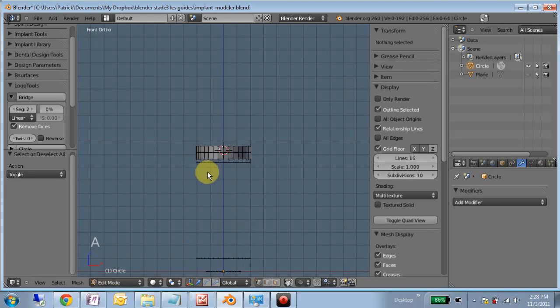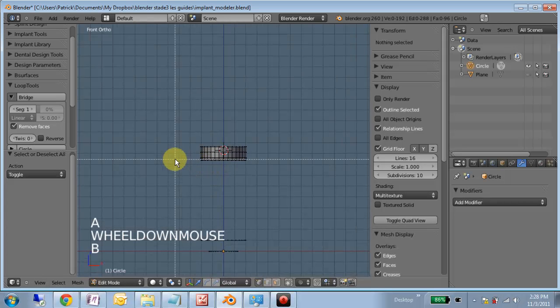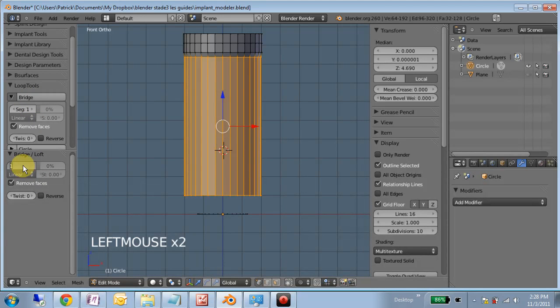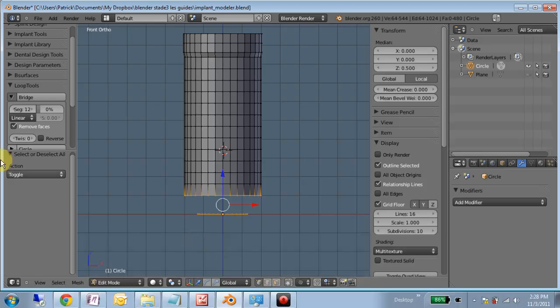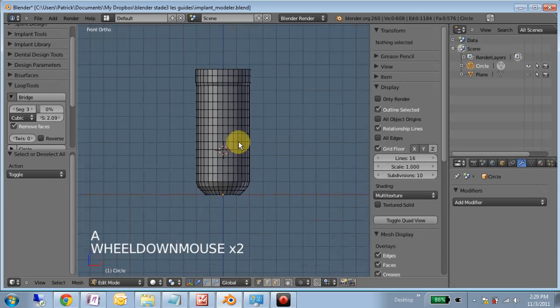Bridge these. A to deselect everything. Again. Looks good. Okay, if you didn't want this to be perfectly linear, you can select cubic, and you can play with this factor here. I'm content with that for now. So now we have the basic shell, the body, and the collar planned.